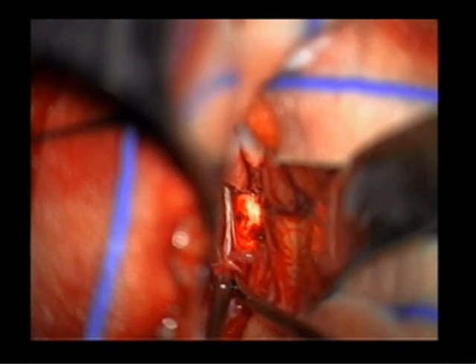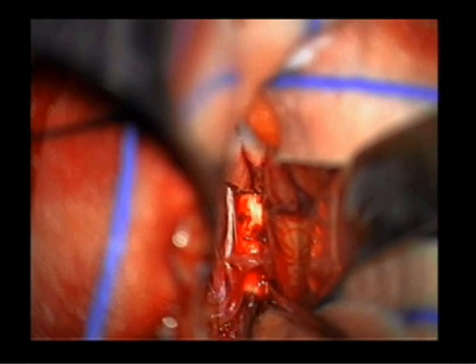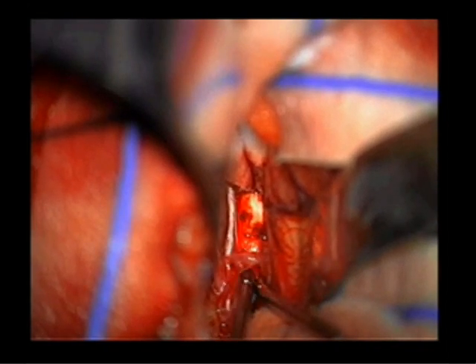It is helpful to completely expose the length of the callosum before beginning the callosotomy.